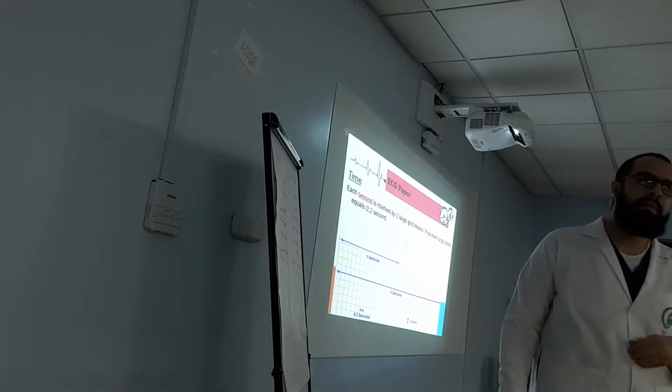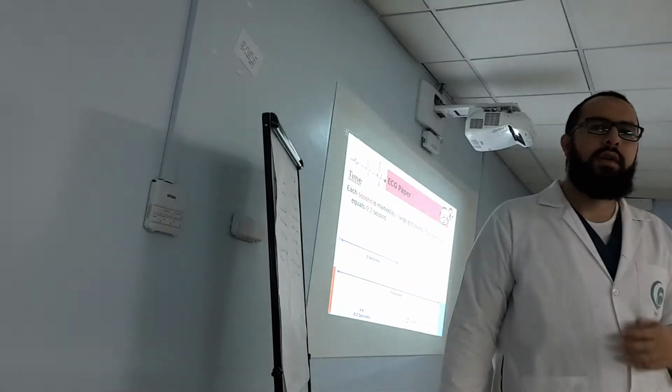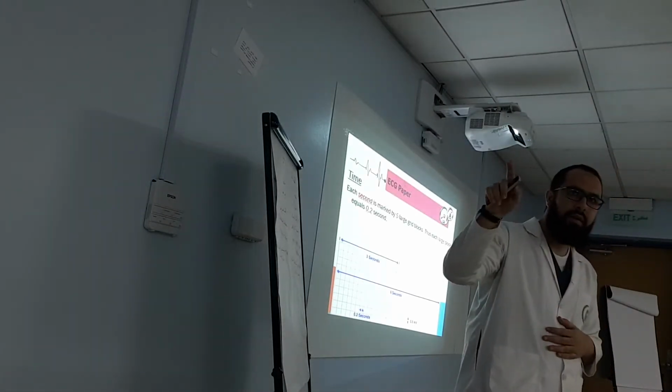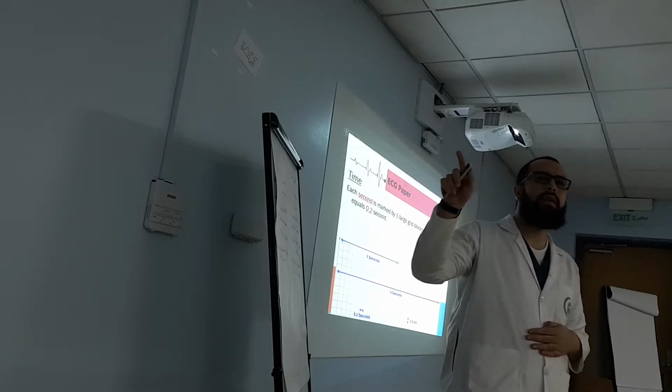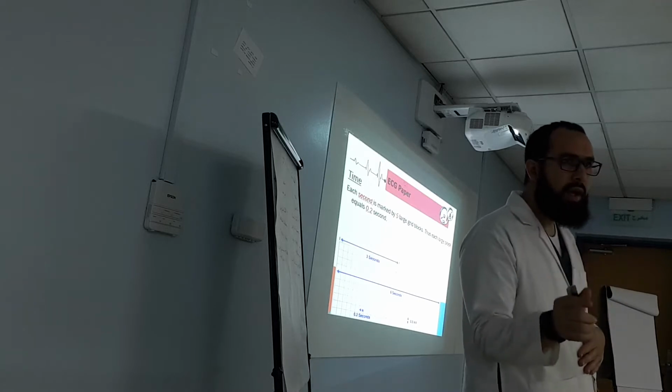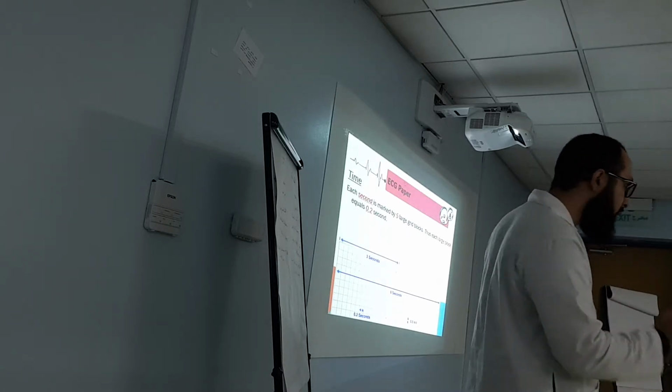Anybody got a different number? All got the same number? Yeah. So 0.04 is a small square. Okay? 0.04 seconds is a small square.